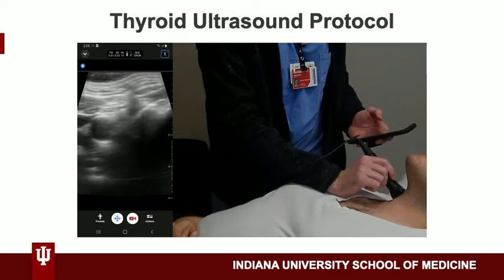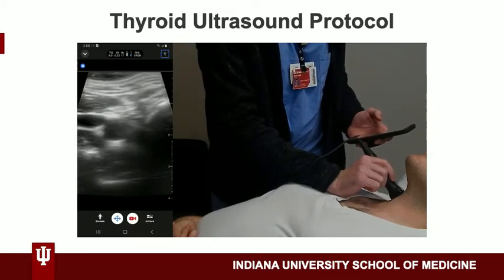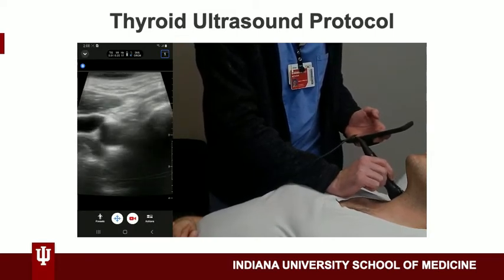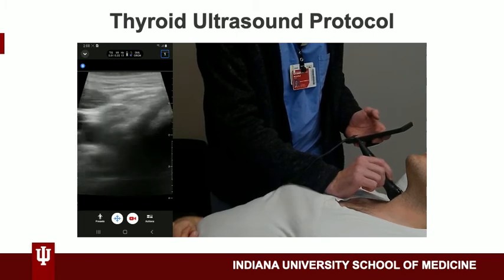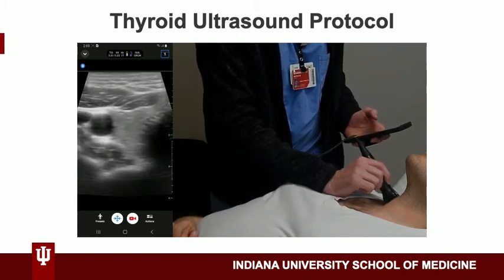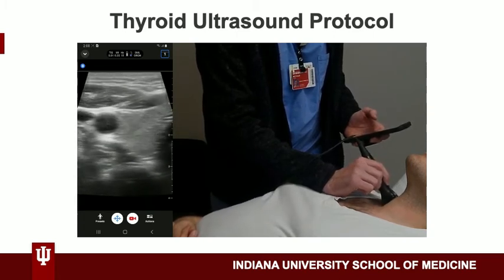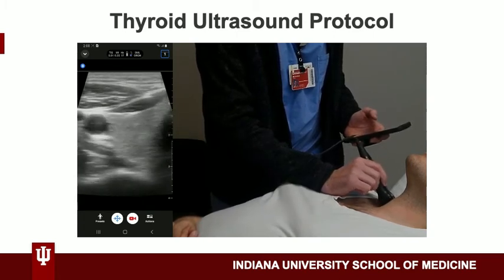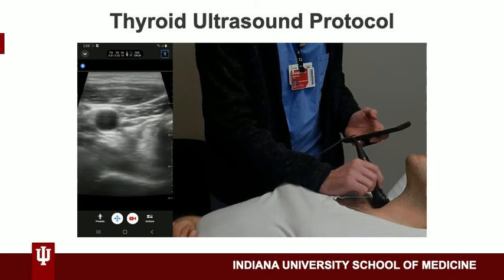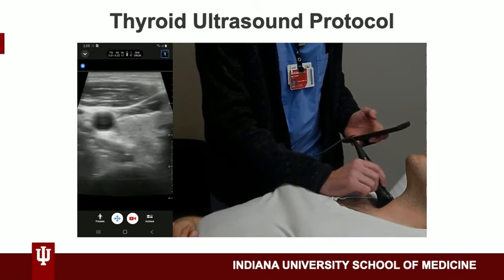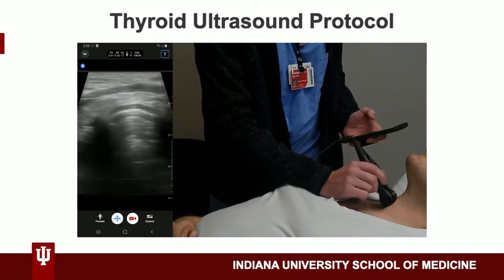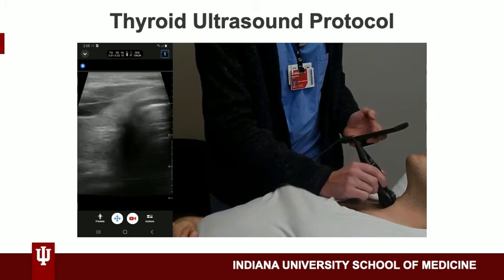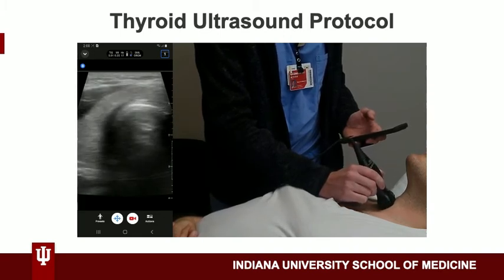When you begin scanning, you will want to start at the uppermost part of the right lobe of the thyroid and then scan down to the bottom. While doing this, try to identify surrounding structures, get measurements, and look for nodules. Then slide the probe over to look at the isthmus.